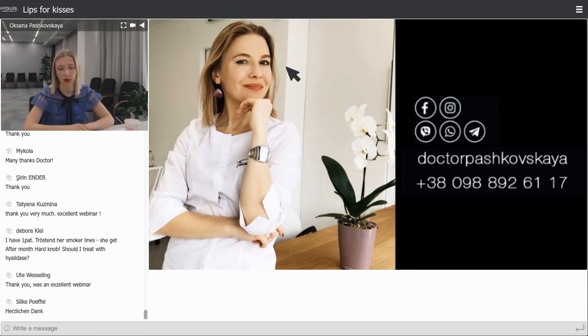I don't know about your country, whether you have hyaluronidase or another drug, but in Ukraine we have lidase and hyaluronidase. I use hyaluronidase. Thank God, I never had ischemia in lips, and I just know the first signs, and want you to pay attention to the signs, to be ready for such a situation, and to keep enough hyaluronidase in your office, because it's the main measure to manage ischemia.